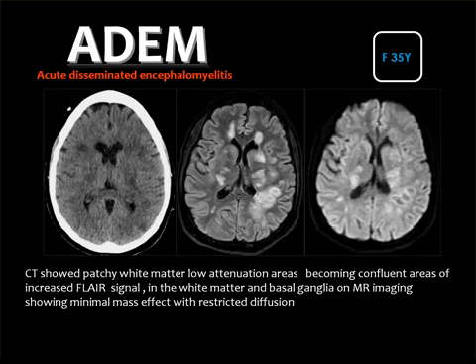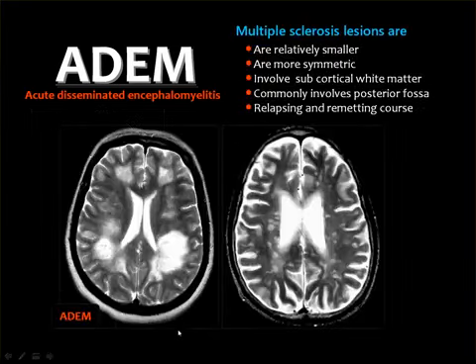They do not show diffusion restriction, but in many cases presented on the internet, they show diffusion restriction. The explanation for this depends on whether the lesions are acute or relatively chronic. In acute lesions, you suspect that these lesions will show some diffusion restriction, but in relatively old lesions, you will not see this diffusion restriction.